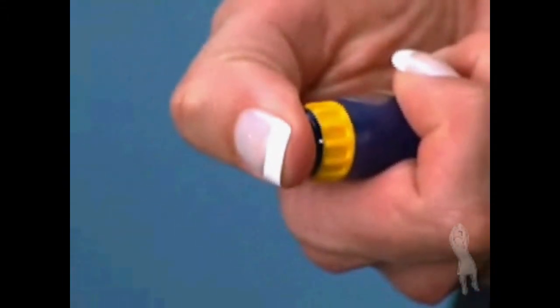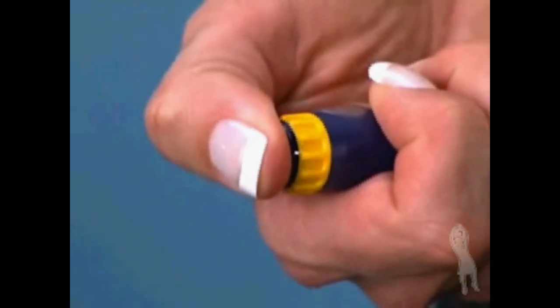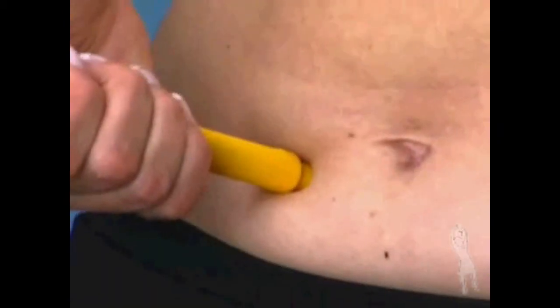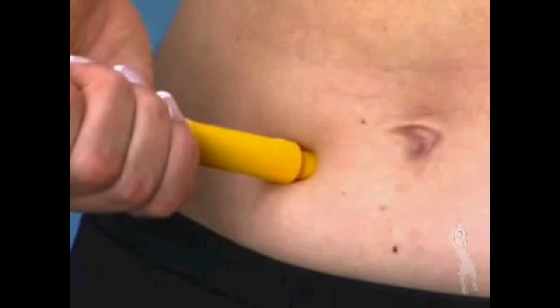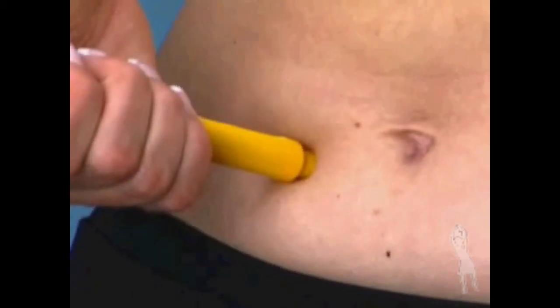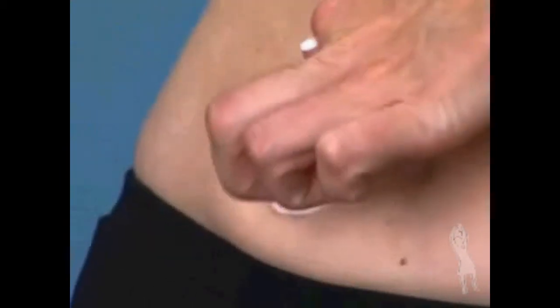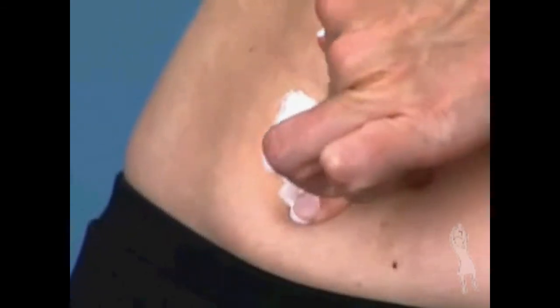Press the injection button all the way in to be sure you have given the full injection. Wait for five seconds before pulling the needle out of the skin. Pull out the BD Microfine needle and firmly press down on the injection site with a gauze pad.